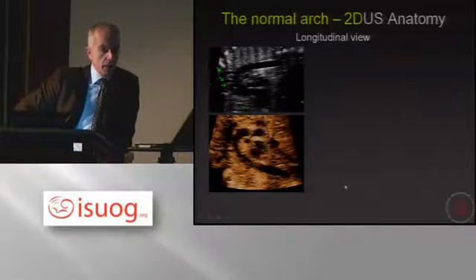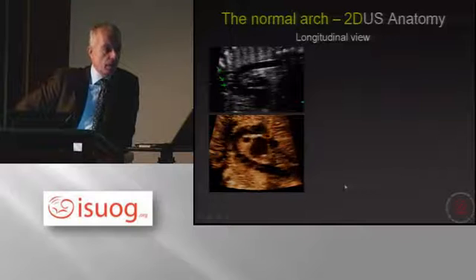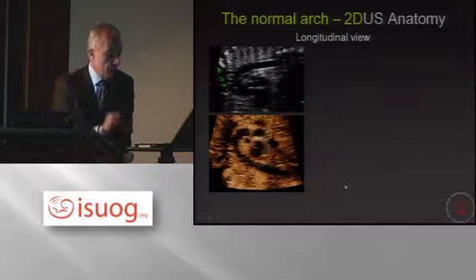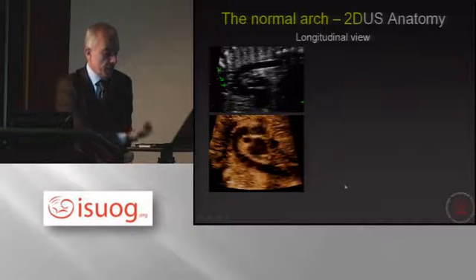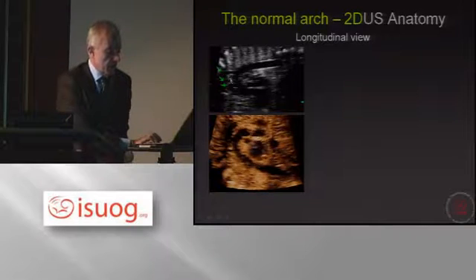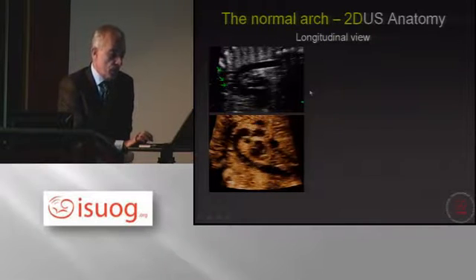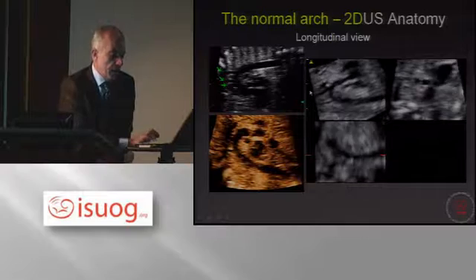First of all, historically, the diagnosis of aortic coarctation was made by looking at the longitudinal view of the aortic arch that you see here, and trying to get the view with the three neck vessels and find out whether the size of the aortic arch was narrow or not. But then this was abandoned, and I show you why with the help of a volume.